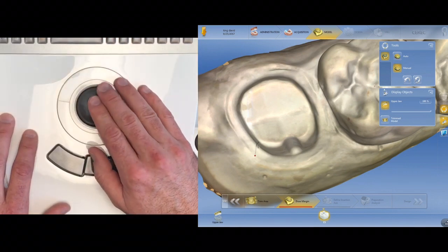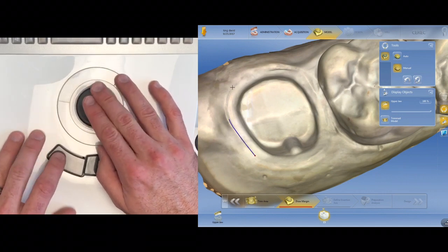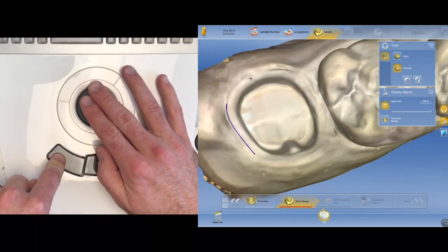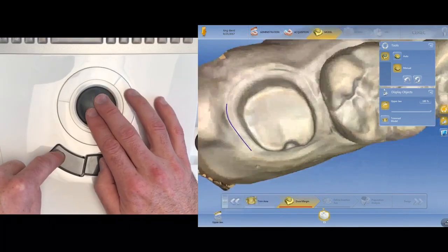Now we have a white line, and I'm going to go ahead and marginate. So single click, single click, single click, single click. If I want to, I can press and hold, and now I can rotate the model just like you could rotate with that left button. And if I'm holding, it's not going to activate the margins.